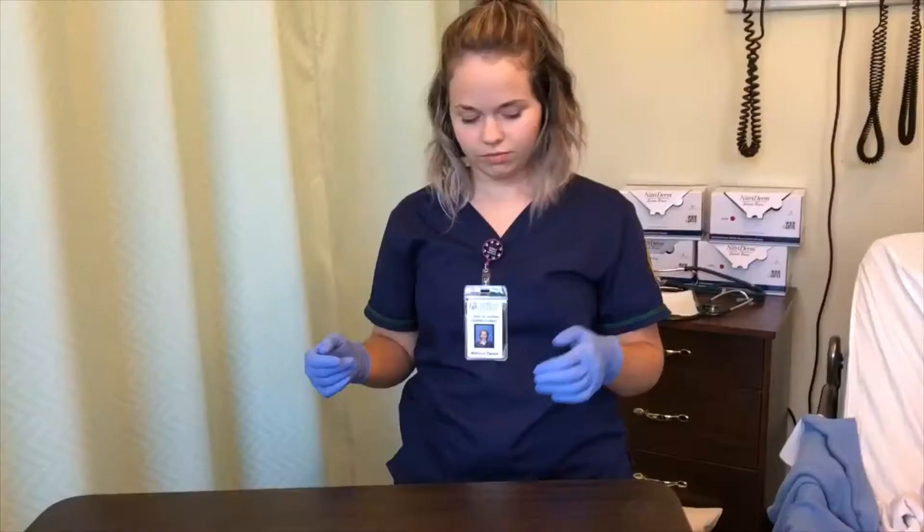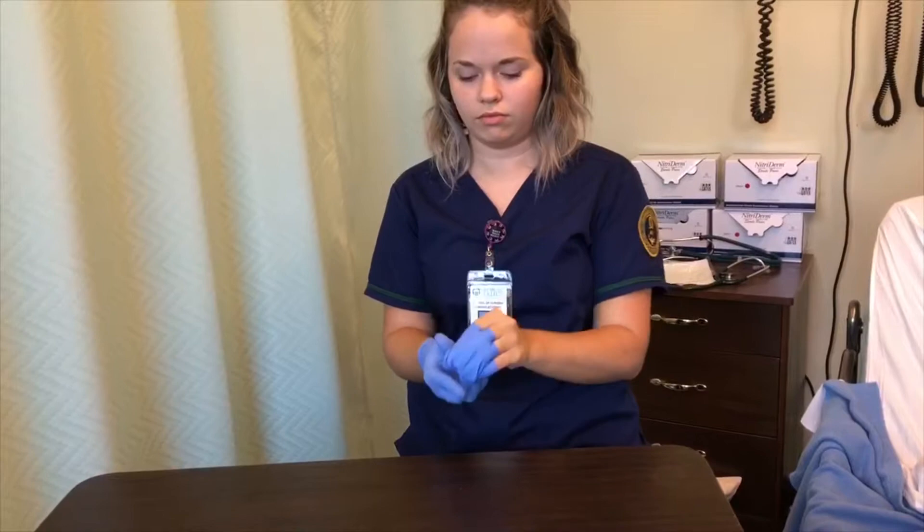The procedure was successful. Now she's ready to remove her sterile gloves. She's taking them off making sure not to touch her skin in the process — she bundles up one glove, pushes it into the other hand, and throws them away together in the trash can. Happy patient, happy nurses.